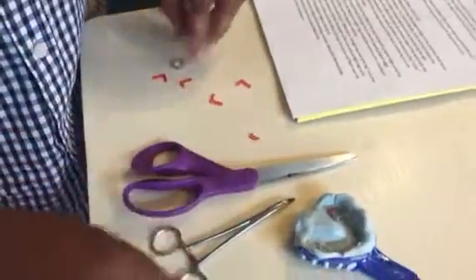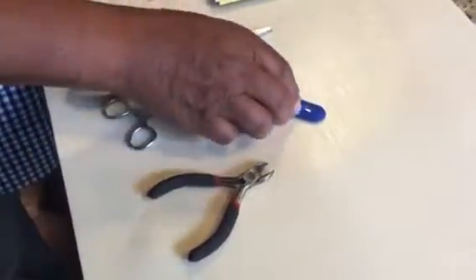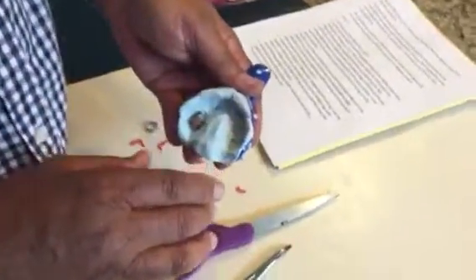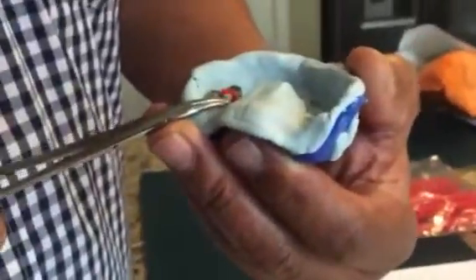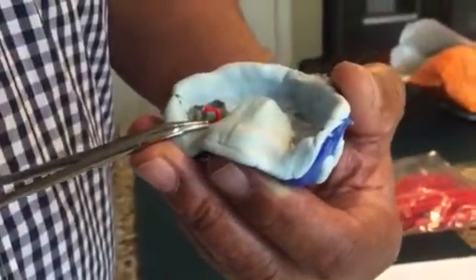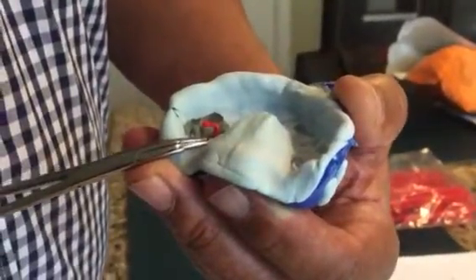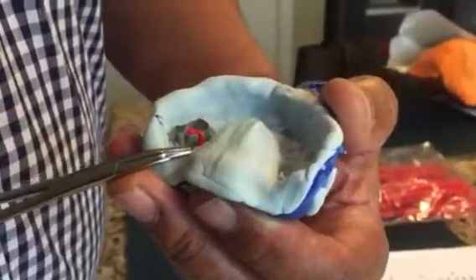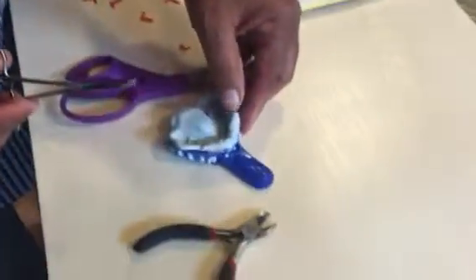To maximize the seating of the Dballock straight leg and curly leg into the alginate material, shorten the length of the curly and straight legs as I've indicated. And this is what it should basically look like if you have seated that Dballock successfully. Right through that area there's no daylight because the Dballock is seated straight down onto the gingival edge of the stainless steel band. Duplicate procedure number 5 by placing another Dballock diametrically opposed to the first Dballock that you seated.